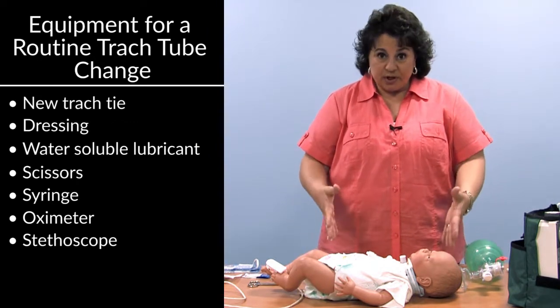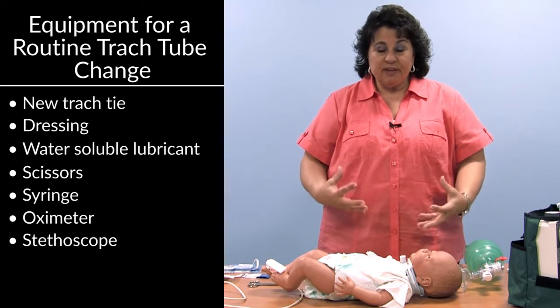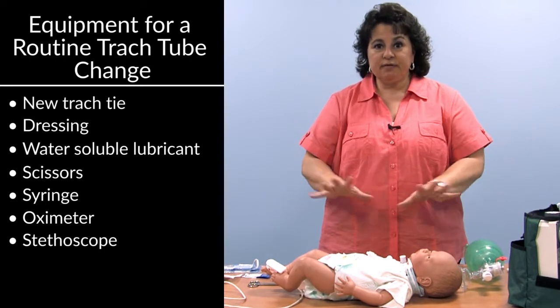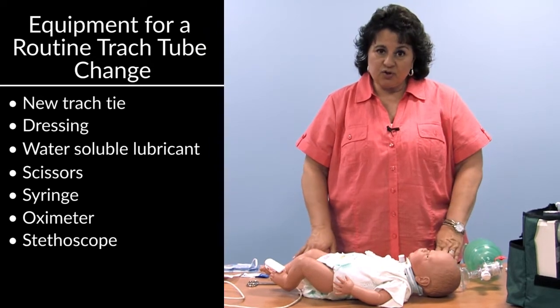Always remember, look at your child. Look at your child's face. Are they looking at you with fear? Are they looking at you with color change? Those are the things you want to look for first, before you start fumbling for other equipment, should there be any difficulty with the routine tracheostomy change.